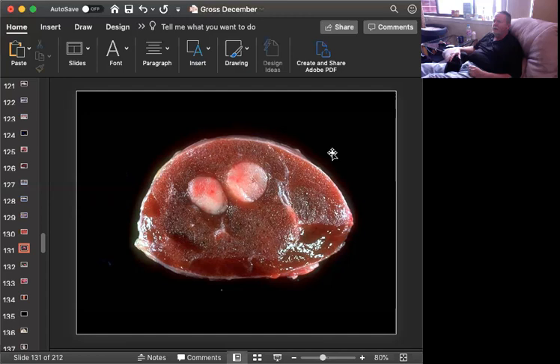so accustomed to calling these follicular adenomas. They often had follicular-like structures, some of them had incipient follicles, all the morphologic markers of follicular neoplasms. Well, then people started actually putting immunohistochemistry on them. And believe it or not, the majority of my experience, now that I put a lot of immunohistochemistry on them when I get them, is that these are not follicular in origin, but they are C-cell tumors. They are benign. They don't metastasize, okay?